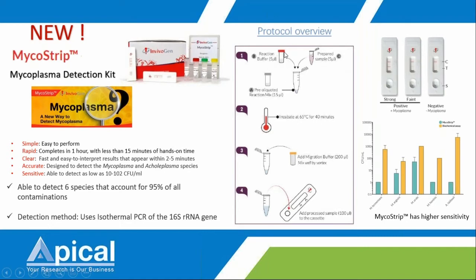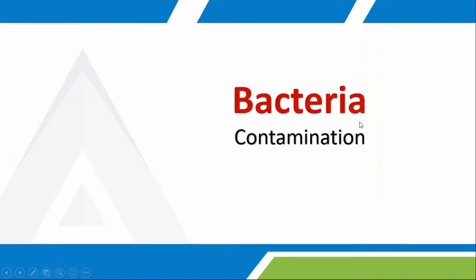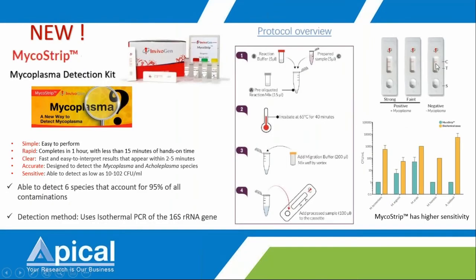Then you have your reaction buffer, which you insert with your reaction mix. You incubate it at 65 degrees Celsius for 40 minutes, and then you add the migration buffer, mix it, and directly add it into the cassette. It is very direct: if you have two bands, even a faint band, it is still positive for mycoplasma. If you just have one band present, it means it is negative.